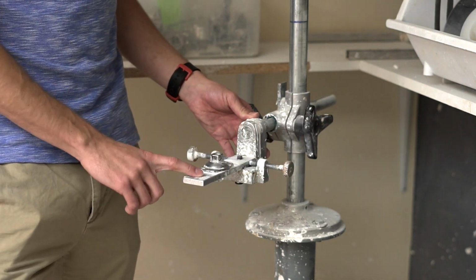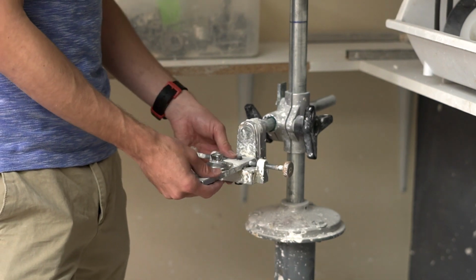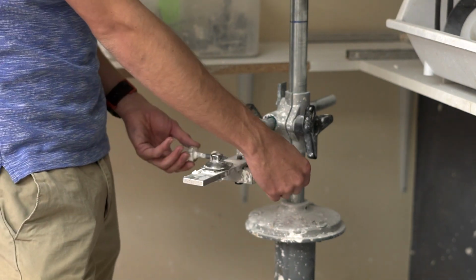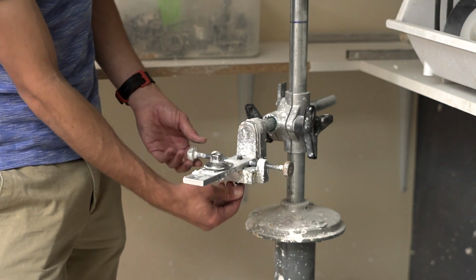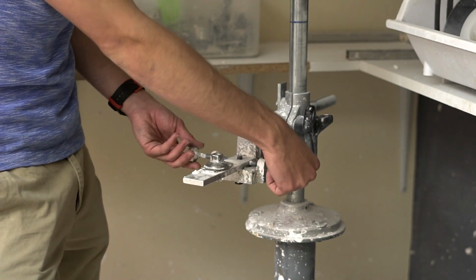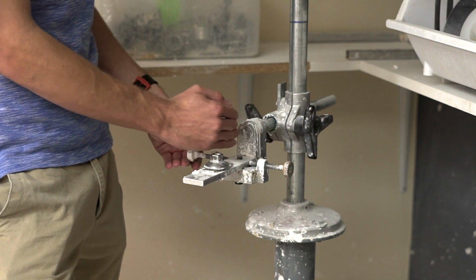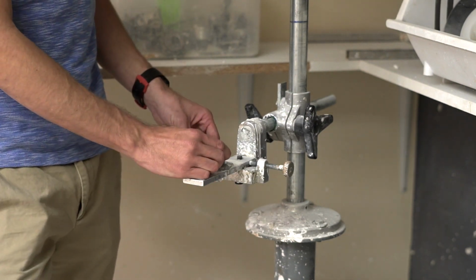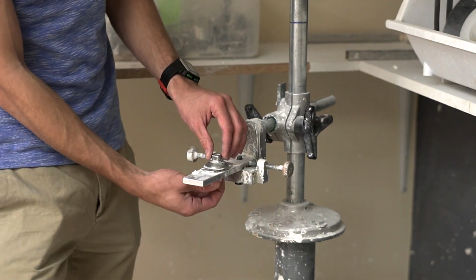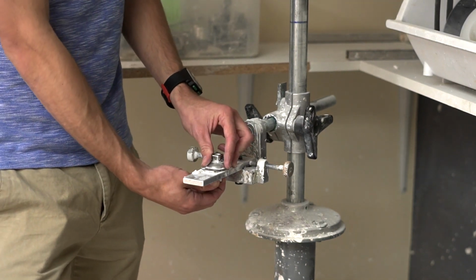The primary purpose of the foot plate is to be able to adjust how much inset you have for the foot, and you do that by adjusting these knobs here. First, you have to loosen the locking screw on the bottom, then you twist these opposingly in order to push the plate one way or the other, and then lock it back in. You could also adjust toe out by loosening the locking screw under here, under the sash foot, and incrementally moving that and locking it back down as well.